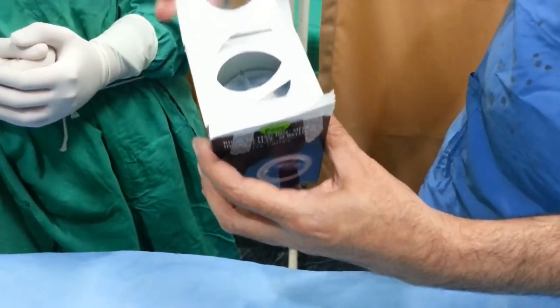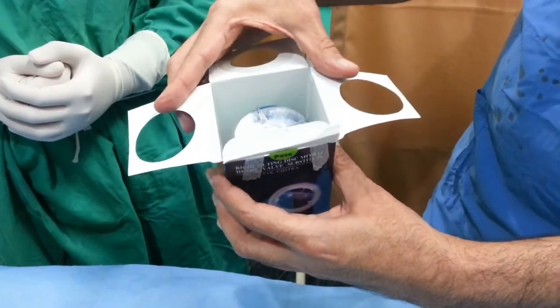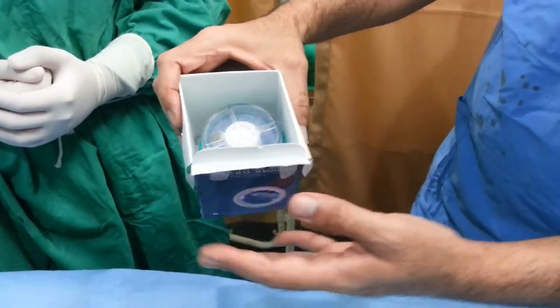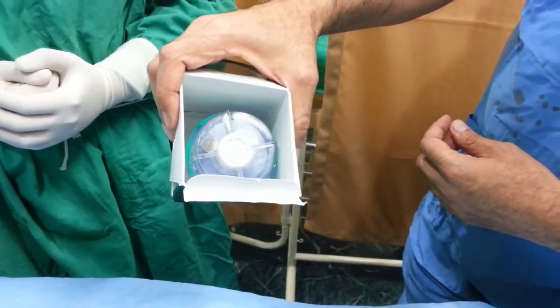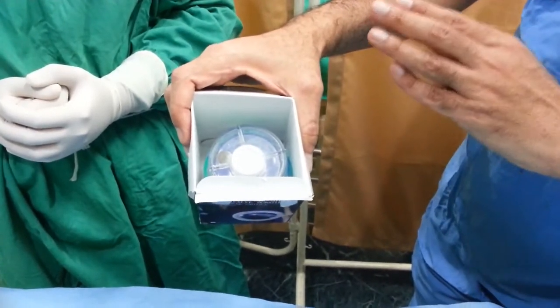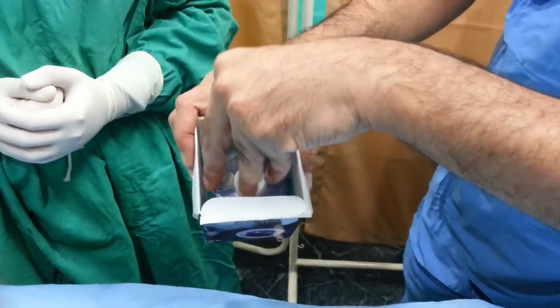Open the flap with the right hand. And open the second flap. And the third flap. And push this aside. At this point, this valve is seen inside. Like this. This is important at this point, not to change the position, because you need your left hand to take the valve out of the box.